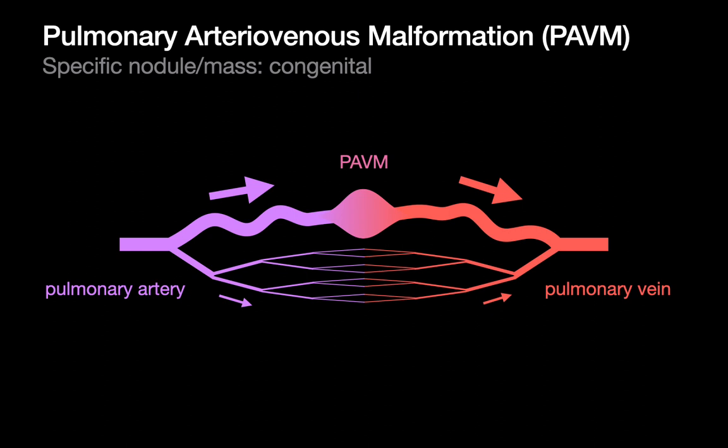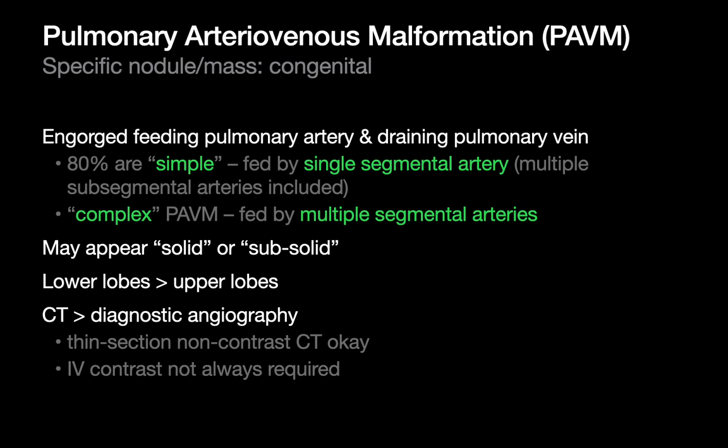This is what we may encounter when we see a PAVM — maybe a bulging area fed by large caliber, tortuous vessels coming and going. That bulging area may look like a nodule, especially on a non-contrast CT. But it will look different in that we'll see large serpiginous or tortuous vessels coming and going from it, which is what lends it specificity. These PAVMs can be divided between simple and complex PAVMs — simple ones fed by a single segmental pulmonary artery, complex ones fed by multiple segmental pulmonary arteries.